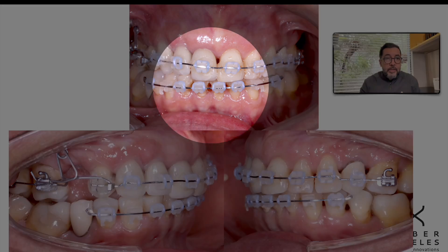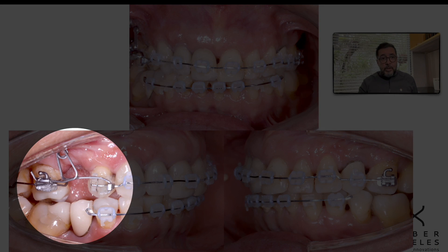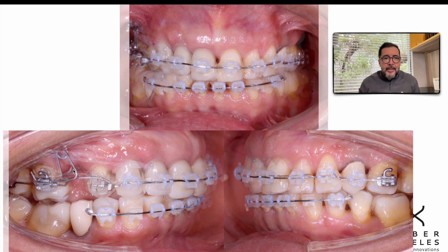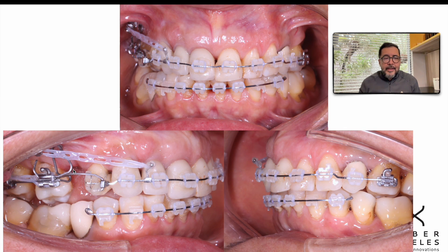I'm closing the space using the delta loop. The delta loop is activating geometry 6 in a symmetric V shape, so I can have in the posterior segment the uprighting of the molar as we are closing the space. And in the anterior segment, we are applying torque using this concept of the V shape. We try to cancel the vertical components with that. So after a while, what we had is the retraction of the anterior segment and the space closure from posterior to anterior and anterior to posterior — very fast.